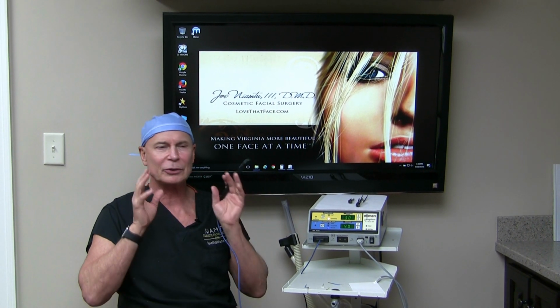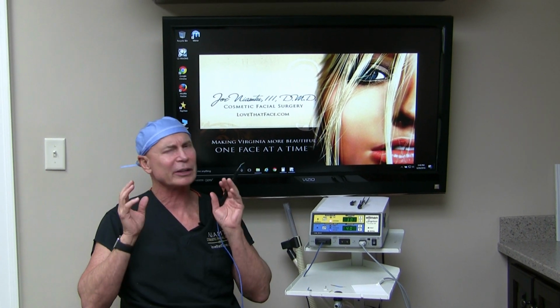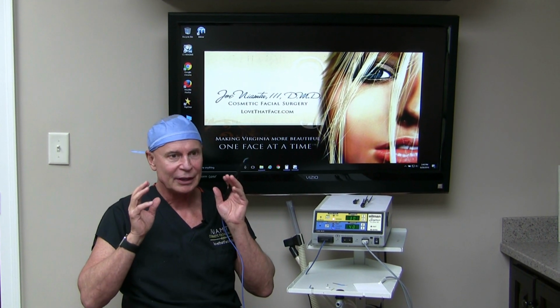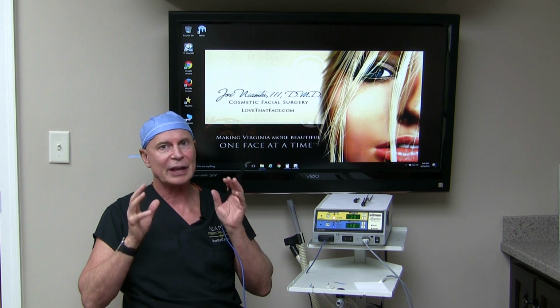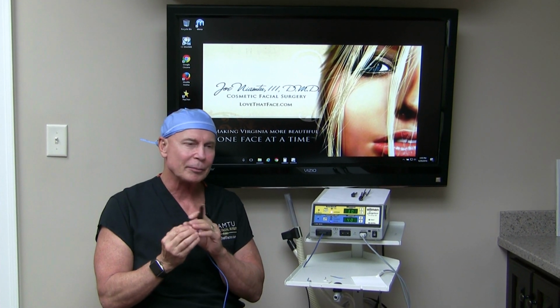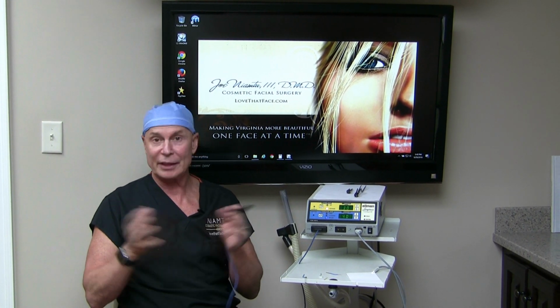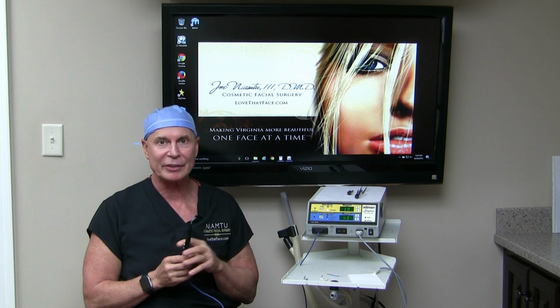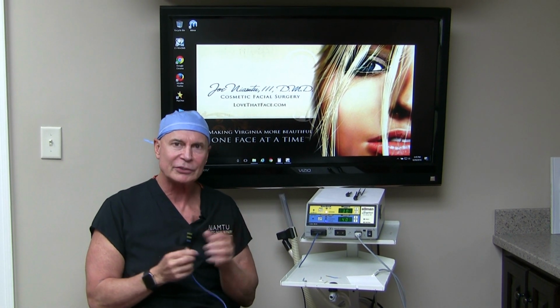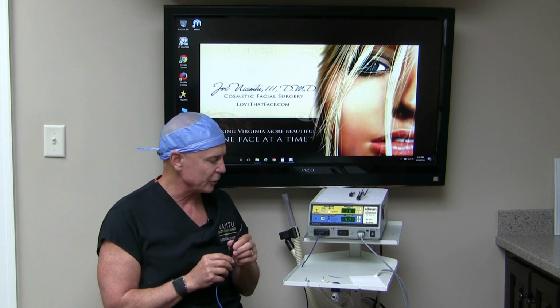They have snoring electrodes. They have palatoplasty electrodes. They have hair transplant electrodes, spider vein electrodes. They have vaginal electrodes. They have myringotomy electrodes. They have matrixectomy electrodes. They have electrodes for about everything. And we don't really use that many specialized ones. This is the garden variety stuff that I'm telling you about.